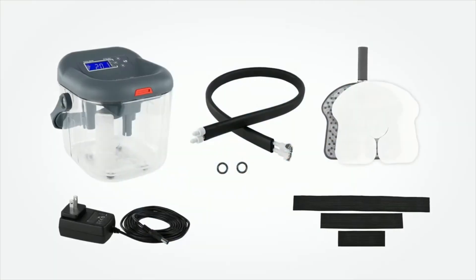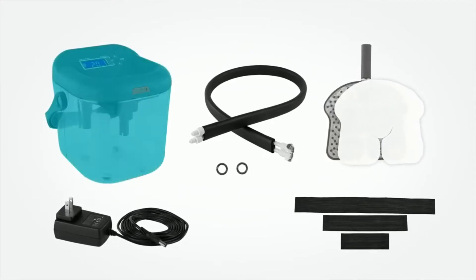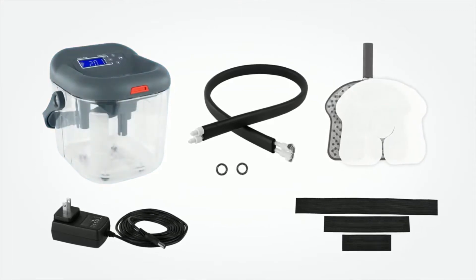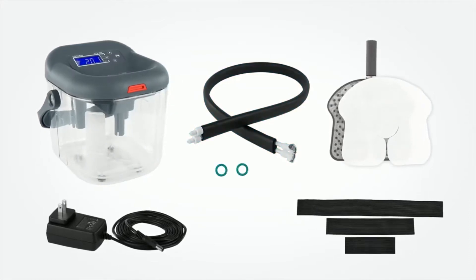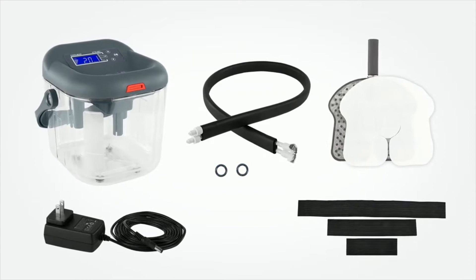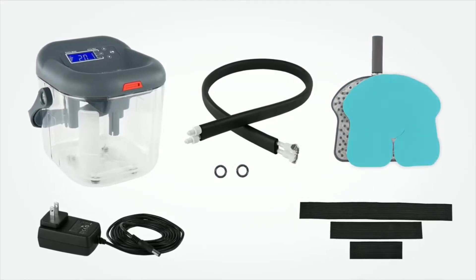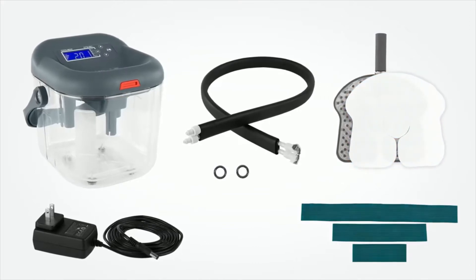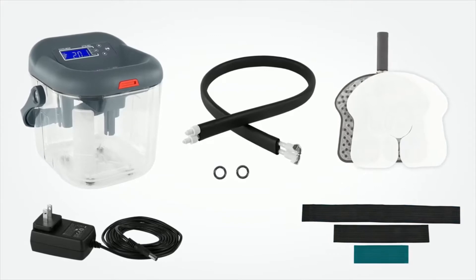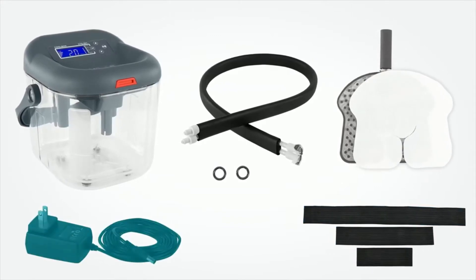With your cold therapy device you will find one ice bucket and lid, one hose with two extra o-rings, one universal cold therapy pad with removable protective barrier, three adjustable velcro straps in small, medium, and large, and one power cord.